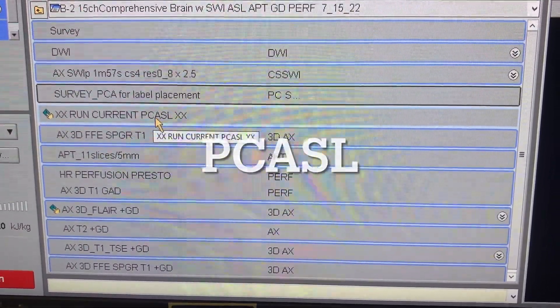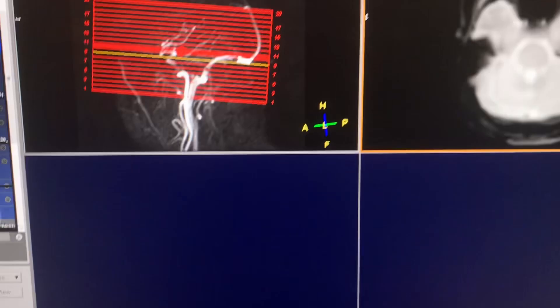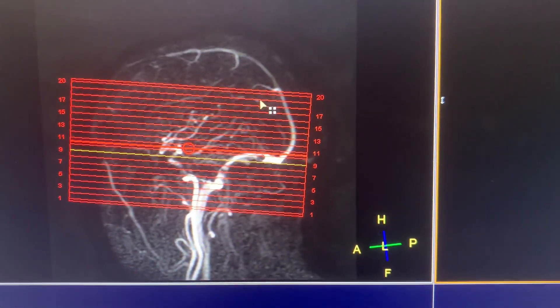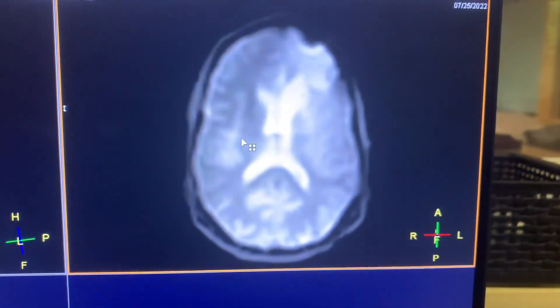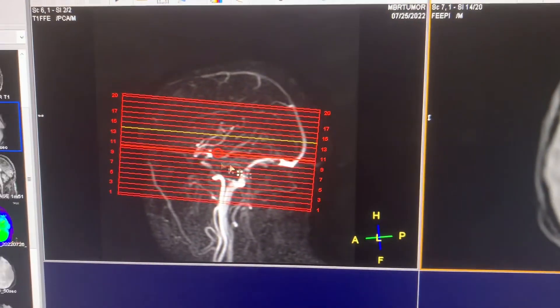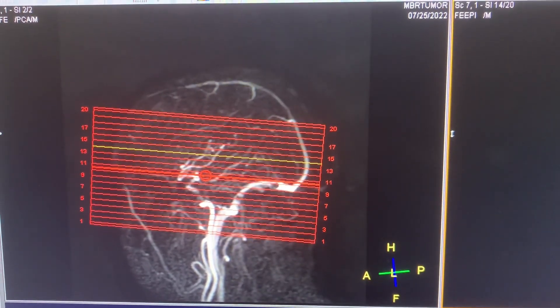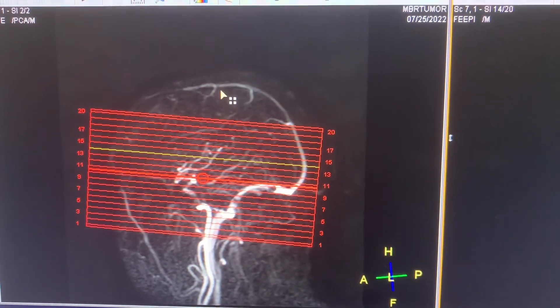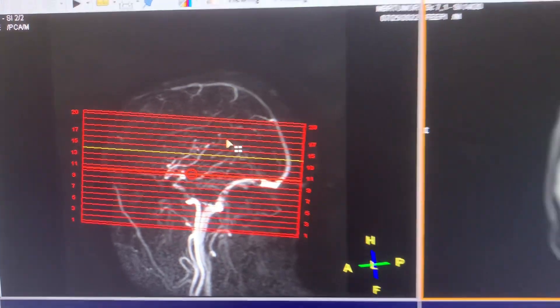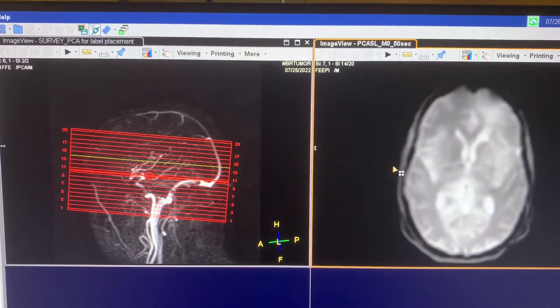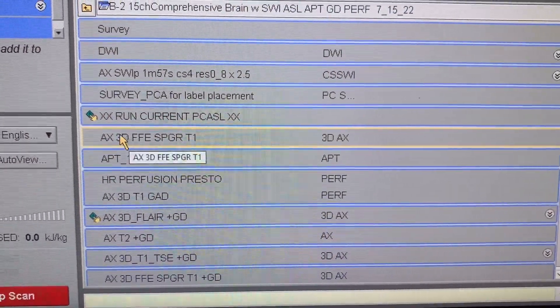For pCASL, run the current one with subs and you also need to run the survey. After you run the survey, this is your routine setting. If you have pathology towards the top of the brain, go ahead and increase slices to cover all of it — that's totally fine. Otherwise it's pretty routine.